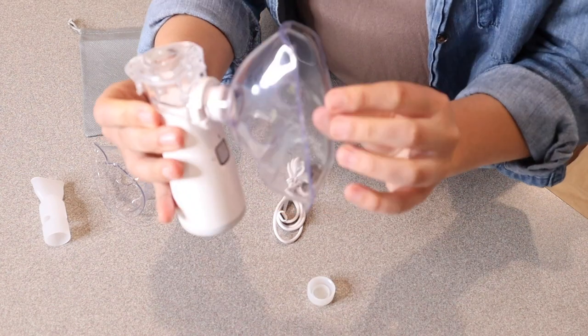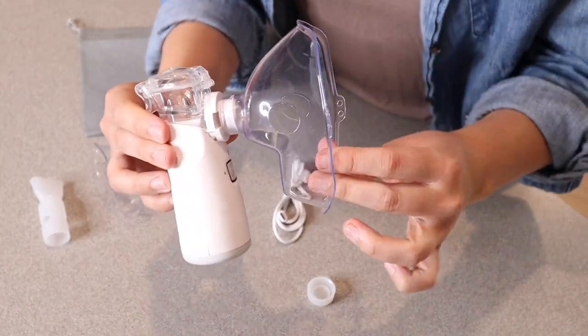Then this one right here is an adult size — same thing, this is going to go over both your nose and your mouth.